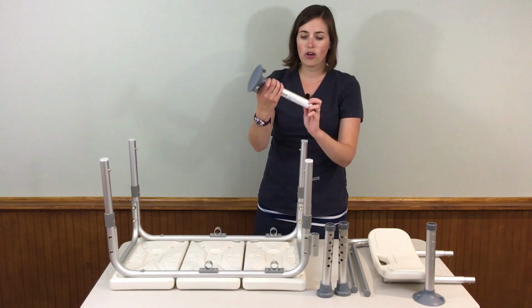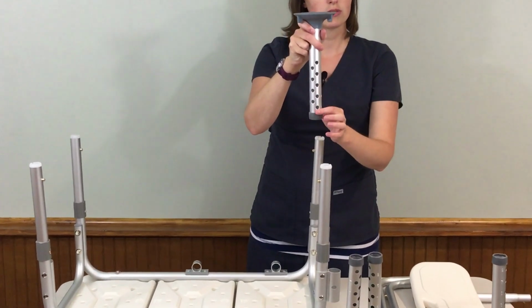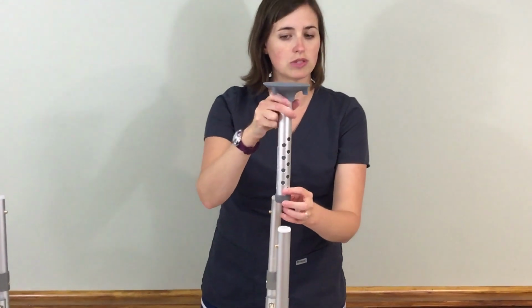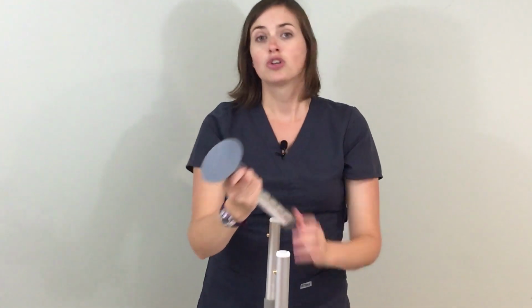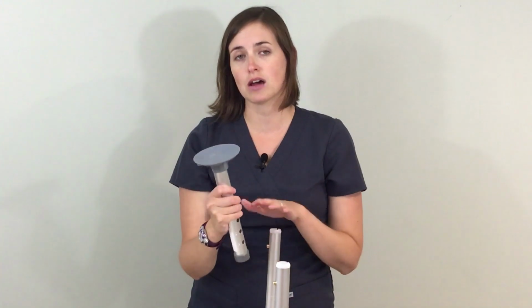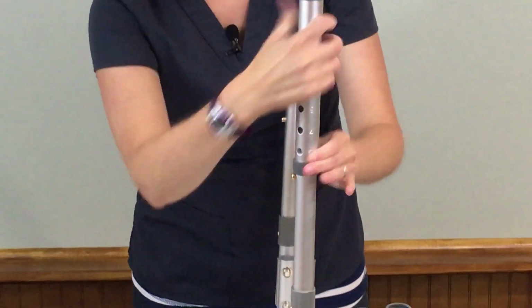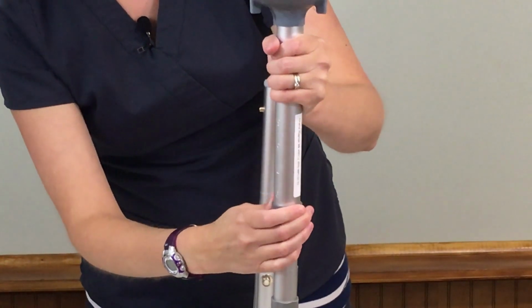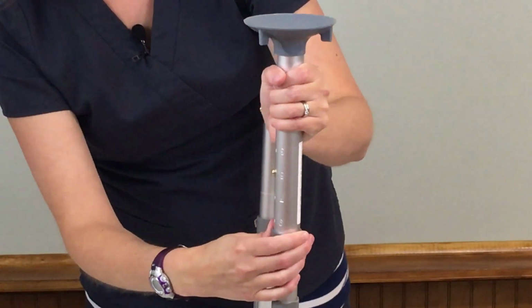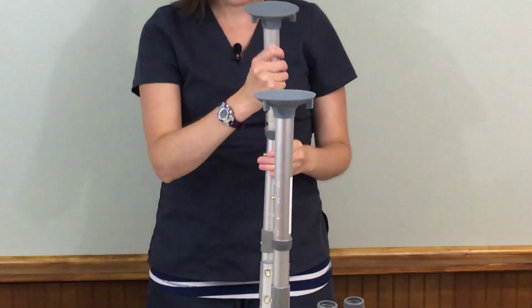Now these legs all have a variety of markers on them. You're going to use these markers based on the height of the person that's going to be using it. So most people can start kind of somewhere in the middle, 5-6 range. You always want to go a little taller than you think you need to, because the higher it is, the easier it is to get up and down from. So I'm going to slide this first one on, and we're going to go to number 5. This one goes all the way up to 9, which will accommodate a rather tall person, somebody well over 6 feet. You're going to put the suction cup ones on the same side.